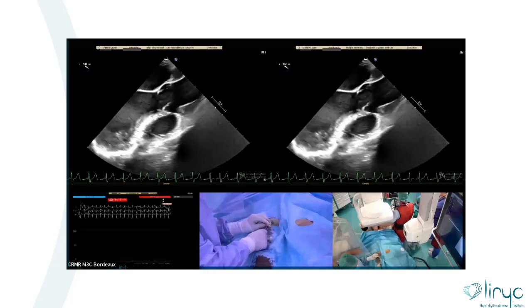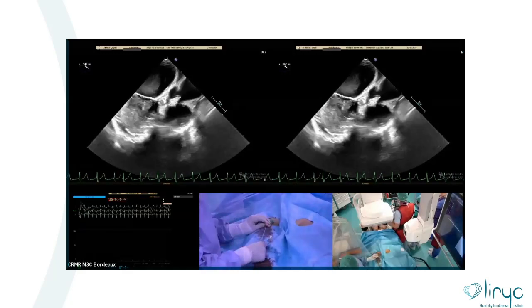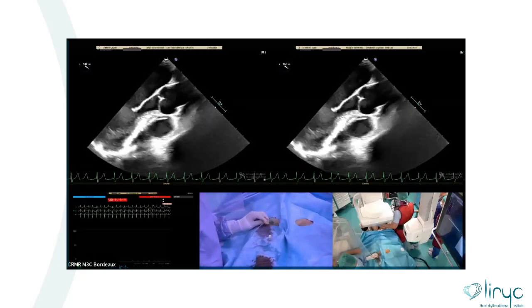It's very easy for the Terumo wire to go to the branch. Yeah, going up. It's not going down. So we should use the curve of the pigtail to help you get the wire past the aortic valve.